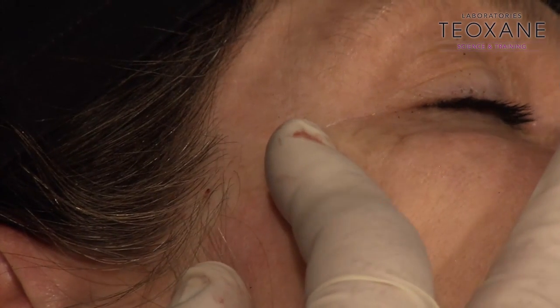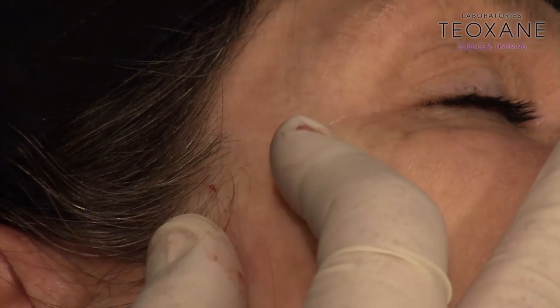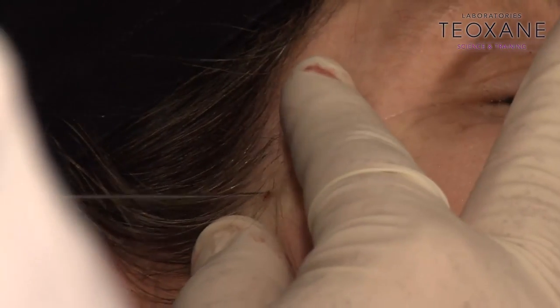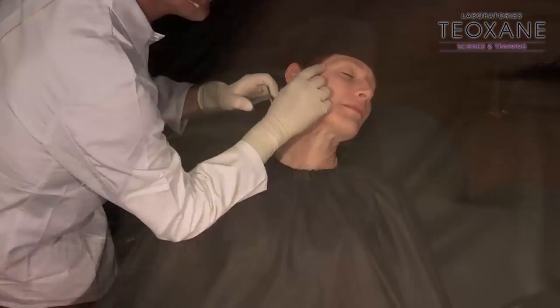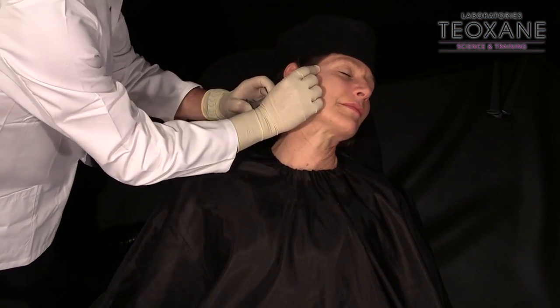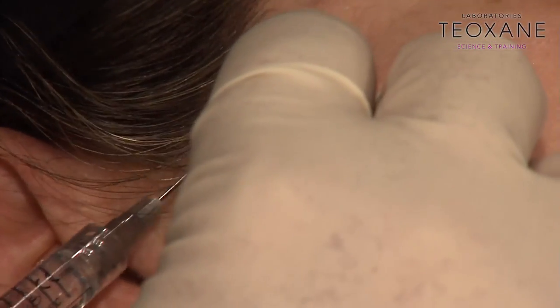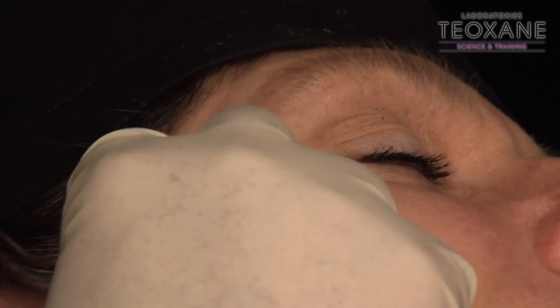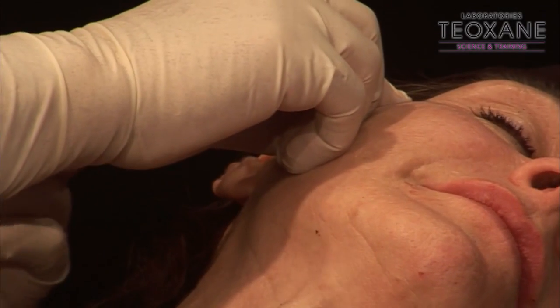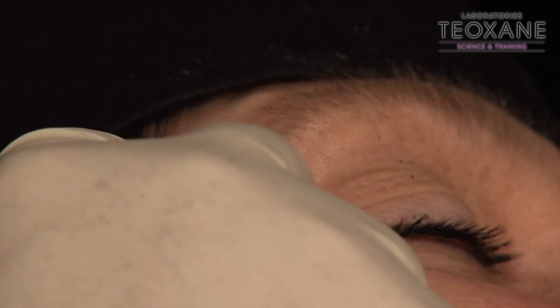Okay. Anna, Sarah, need you. Okay, I'm going quite deep. Here, you see the eyebrow? Can you see here? I'm pushing myself. Can you see? Yes. So I'm going to the temple area, the same way I did the other side. What I'm going to do now is do the work, not talking, so you can see at normal speed how you should work.